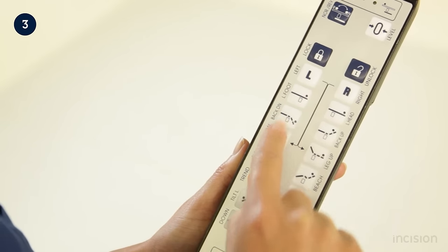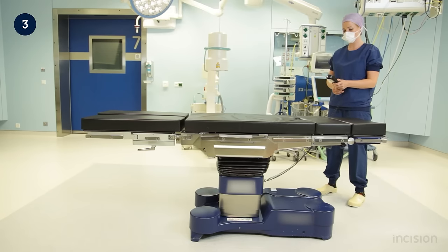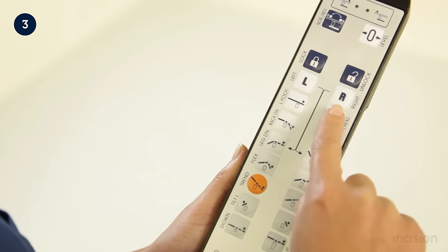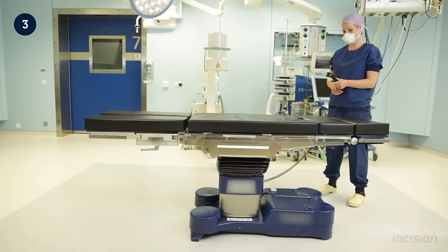Apart from moving up and down with the table column, the tabletop can also move horizontally along the column. This changes the position of the tabletop relative to the table column. Horizontal movement of the tabletop allows the patient's body part that is to be screened to be positioned appropriately for use of the C-arm.